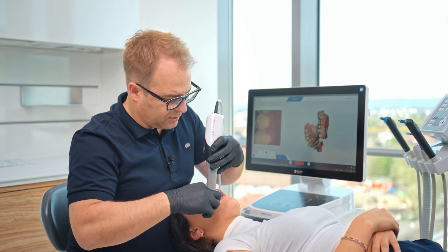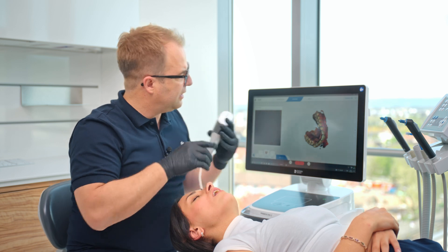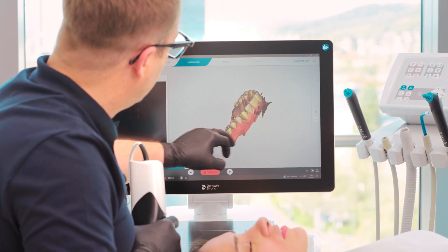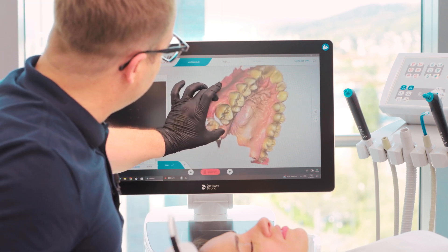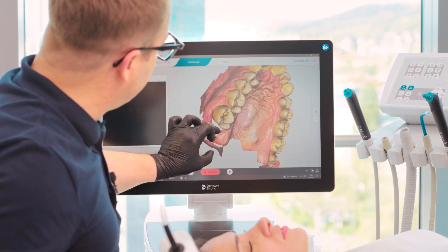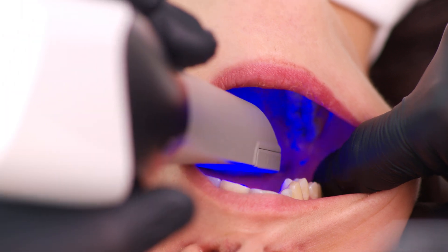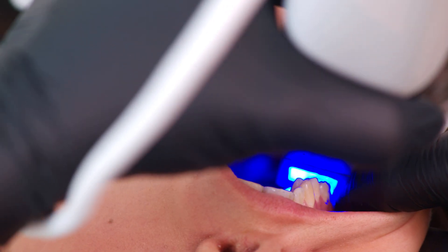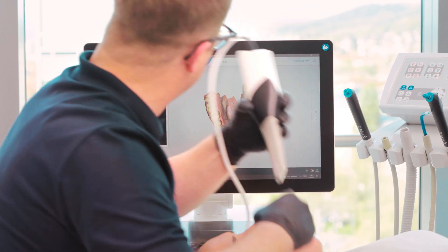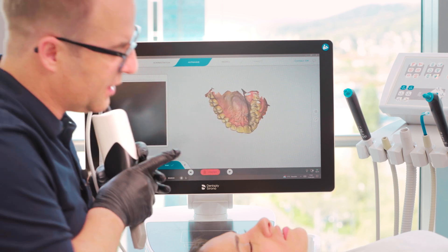I continue my scan here, and this is a beautiful scan. We see that there is a little area missing on this molar — let's scan that. Close a little bit. Move your jaw a little bit more to the right. I will now tilt my scanner. Let's see if it's scanned — there's still something missing.